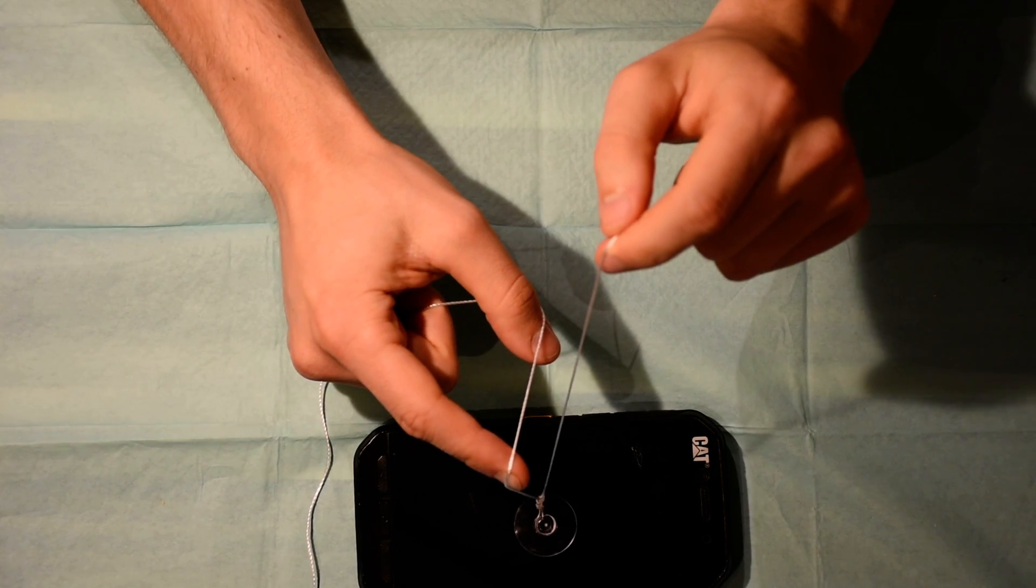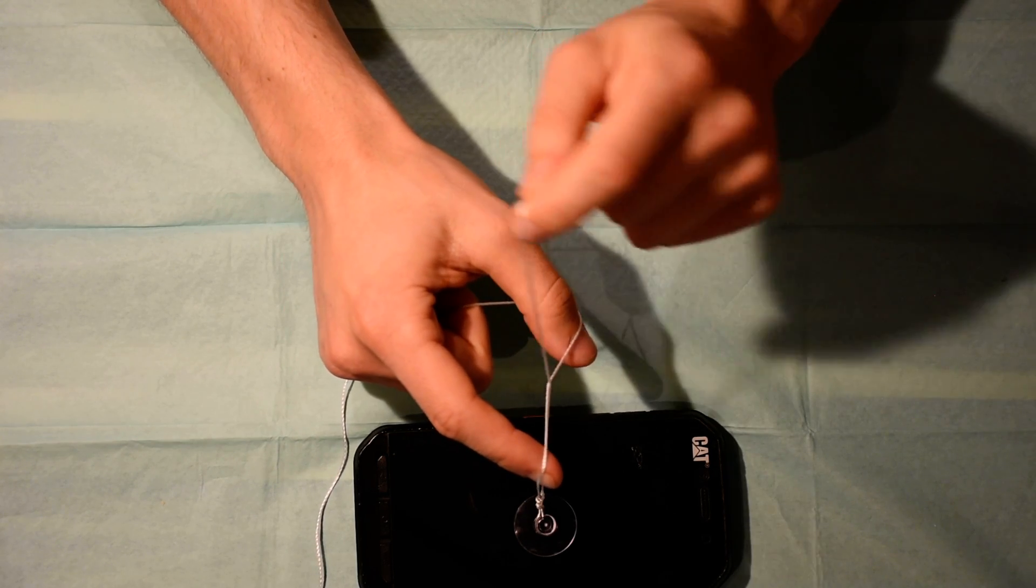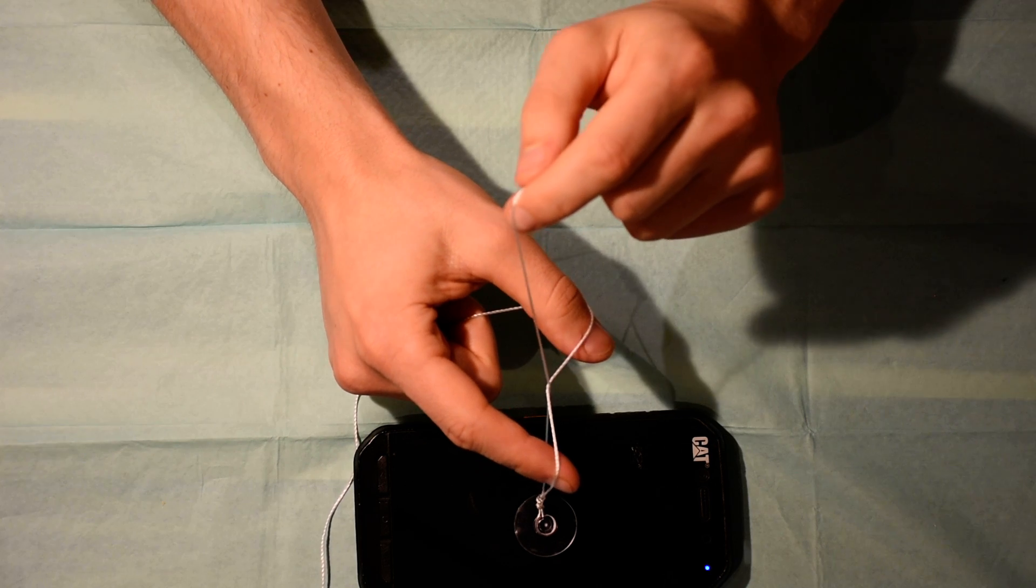This presented cord can be pushed against the other cord like this. You make a small indentation.